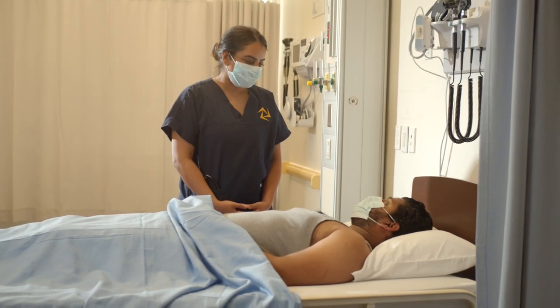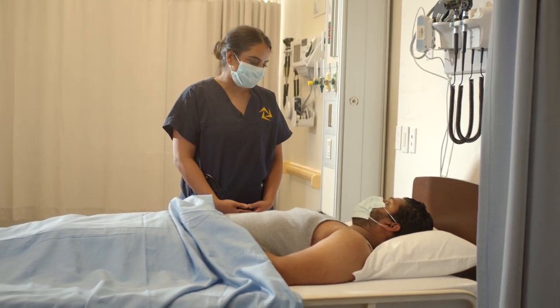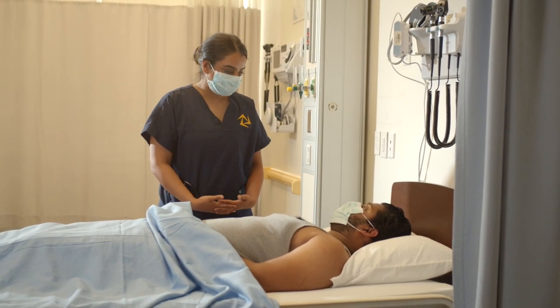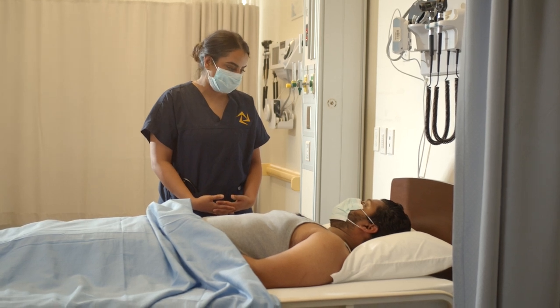I'm going to be assessing your cardiac valves today. It's going to involve me using the bell and diaphragm of my stethoscope to listen to four different locations over your chest. It will involve me exposing a part of your chest. I will only expose the areas that I need to assess. Is this okay with you? Yes.